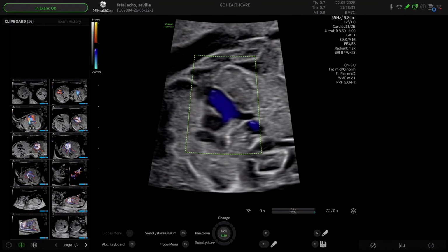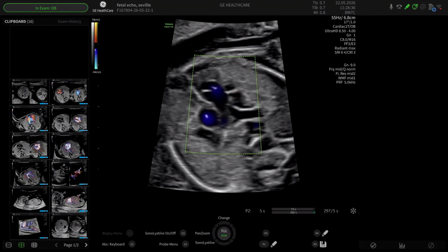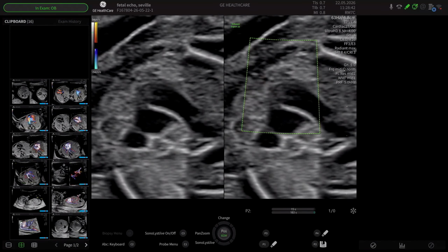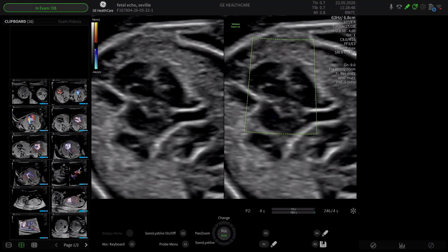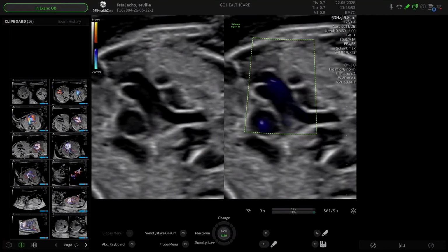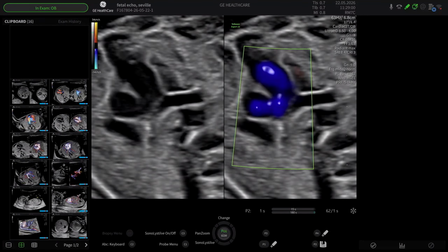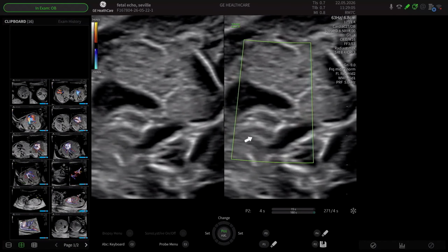And I go through the exact same exercises. The same preset is held over from my left ventricular outflow tract examination. And then again, importance of magnifying the image, splitting it, and then narrowing it down so you're just over the vessel that you are interested in. And then you can tweak your settings of PRF, gain and power output. But looking at that, I can see that there's a normal pulmonary valve that appears and disappears during ventricular systole. And then I come up to see my aorta. The pulmonary artery should be larger than the aorta, which should be larger than the SVC.